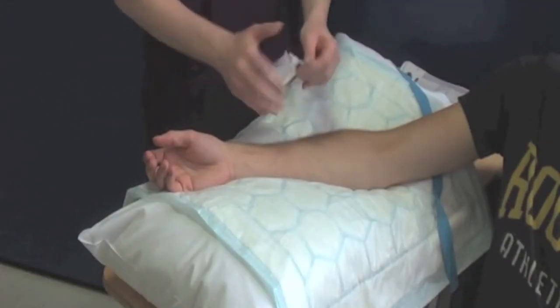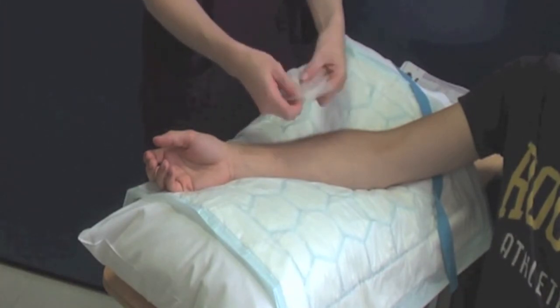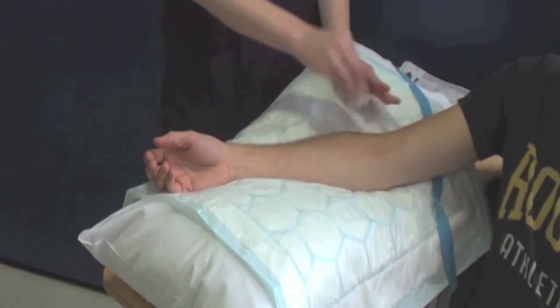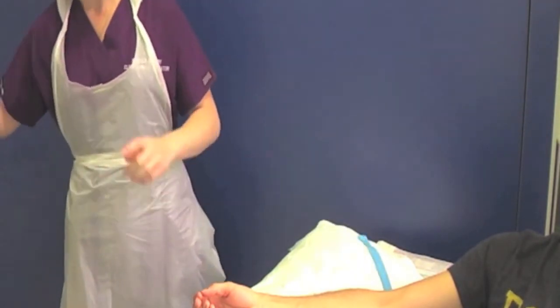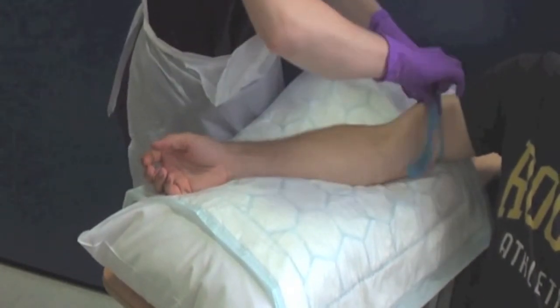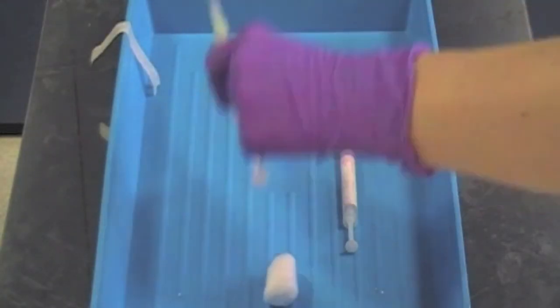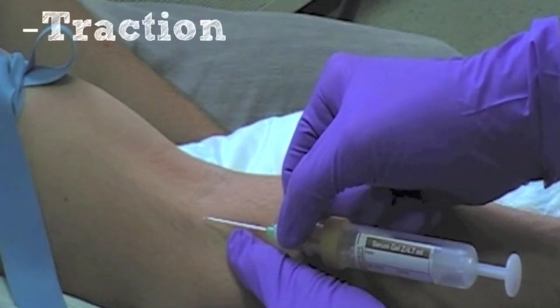Use the Chlorhexidine wipe to clean the patient's skin using a vigorous rubbing action and allow the skin to air dry for 30 seconds. Apply the apron and gloves. Reapply your tourniquet to distend the vein. Do not repalpate the cleaned area of skin. Pick up the first blood bottle and unsheath the needle. Apply traction below and to the side of the proposed puncture site to help immobilise the vein.